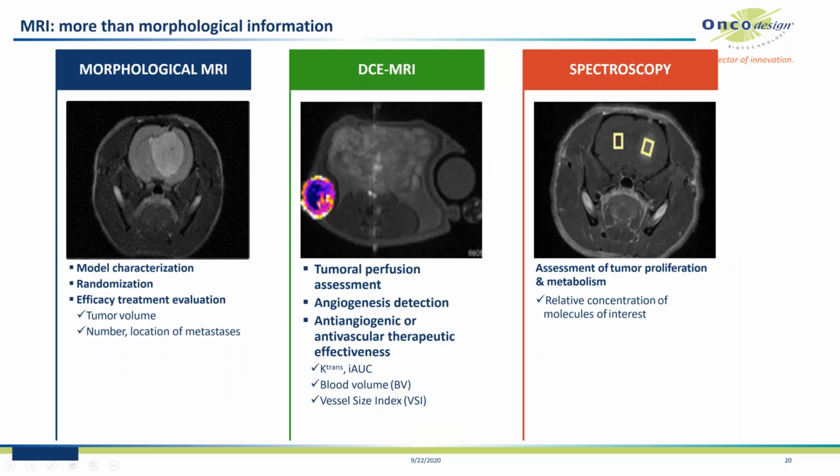So I will continue with some more information on MRI, because I only talked to you about morphological MRI, but you can do more with MRI.